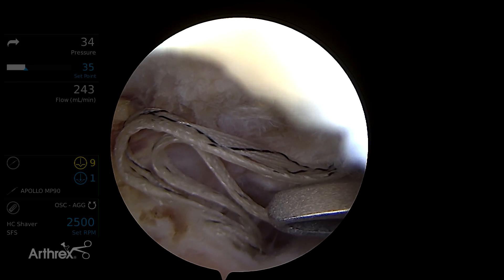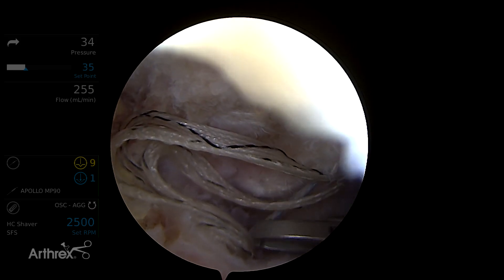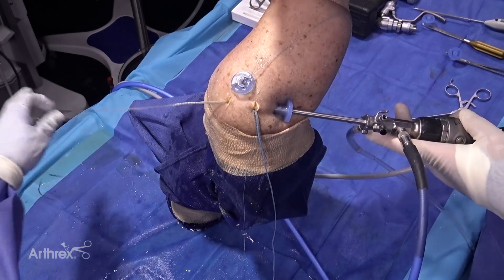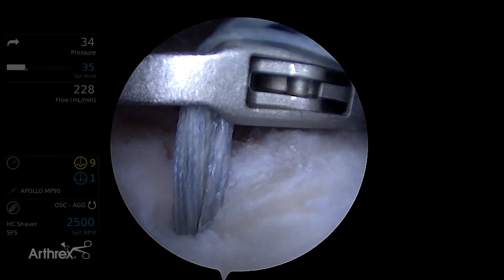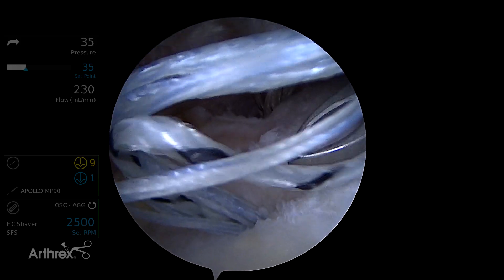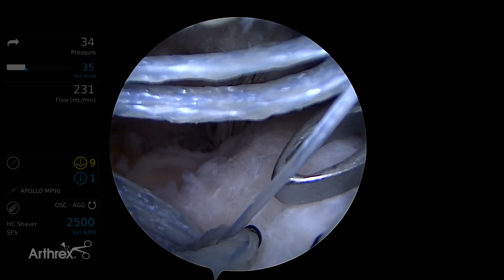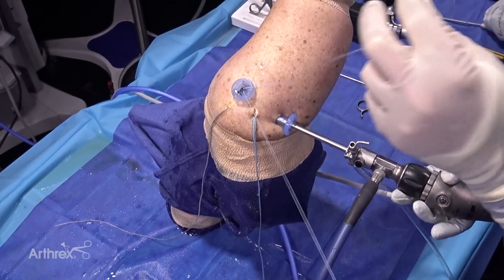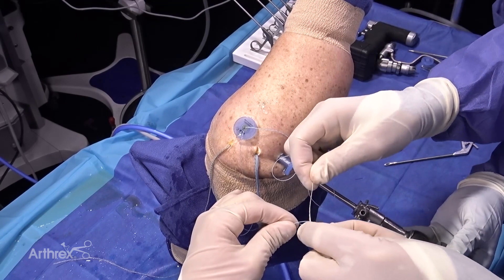What we're going to do is create slack in this entire bundle of sutures coming from that anchor in the front. We're pulling on the one that I do want, which is the working suture. Then we're going to go to the posterior bundle of sutures and do the same thing — create laxity or slack in all of those sutures — and then pull on the suture I want, which is the looped end of the passing suture. We're going to thread the working suture of the anterior anchor through the splice in the posterior anchor.